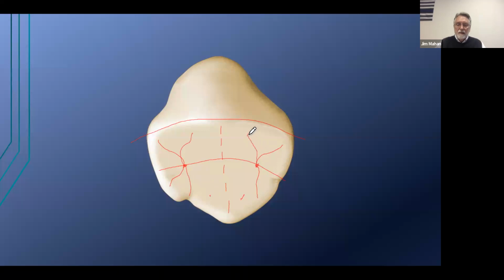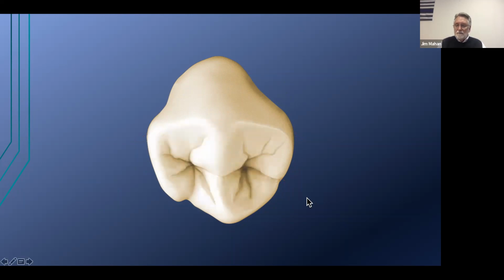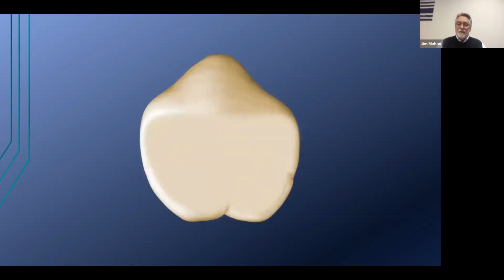Secondary groove. Now notice those stable references that I gave you for where the parts of the tooth go. I've been repeating that over and over. Elongated S, top of the ridge, adjacent groove, secondary groove goes right in the middle, stops just short of the occlusal perimeter. Boom. So there's the tooth that we have. It's going to be the same time after time after time.